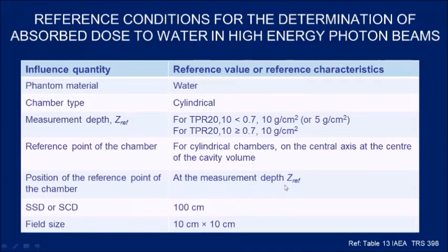We have finished cobalt. Now we will move on to high energy electron beam measurement. Sorry, high energy photon beam measurement. I apologize for it. Right. Let us look at the reference condition.